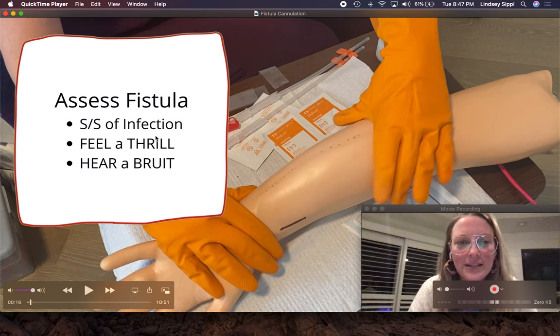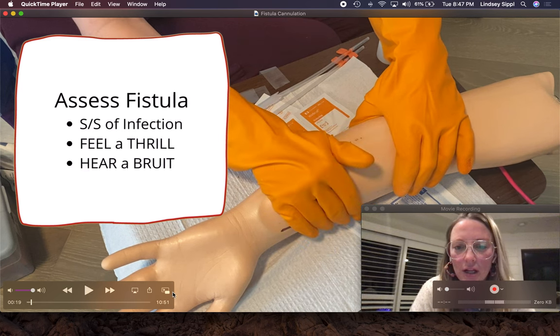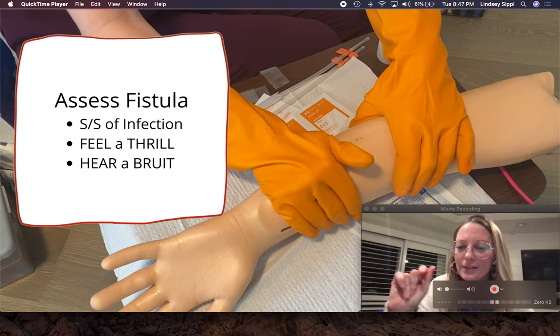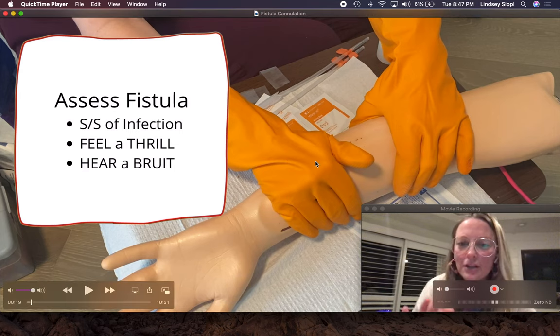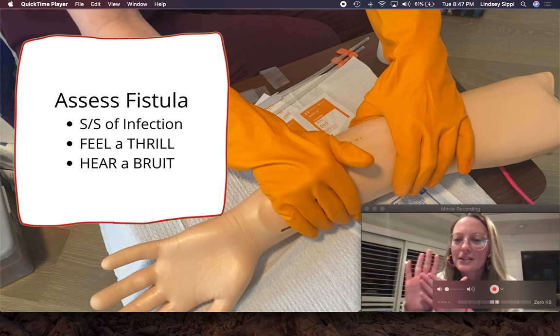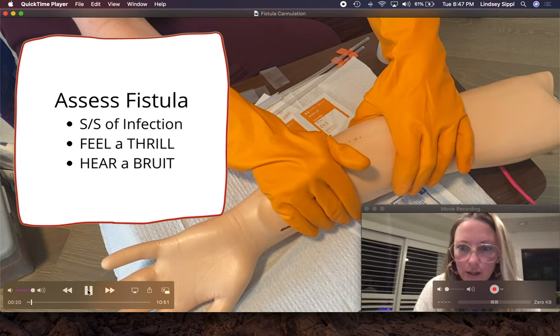Next, I'm going to assess the fistula. I'm going to look for signs and symptoms of infection, any redness, rashes, any drainage. Then we feel a thrill. I've been in dialysis nursing for five years and I used to always feel the fistula with the tips of my fingers. Just last month, somebody showed me to feel with the palms of my hands because the sensation is different there and you can feel the thrill better with the palms of your hands.